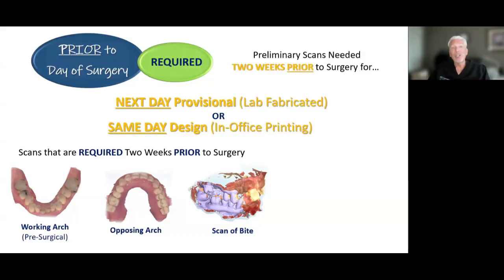You're going to need to have preliminary scans of the working arch, the opposing arch, and a scan of the bite. That's it. That's three of the minimal things. It's nice to get photos and other things, but I'm just saying, you've got to do this.